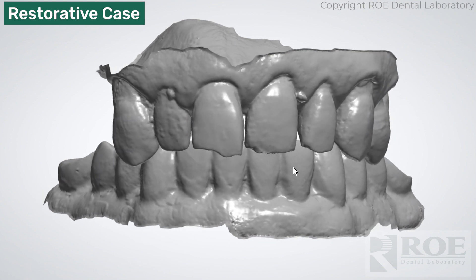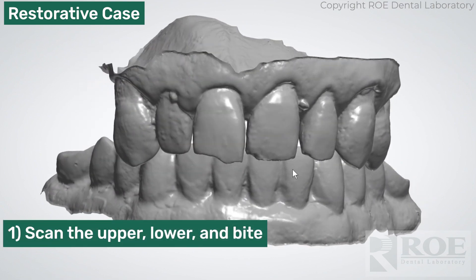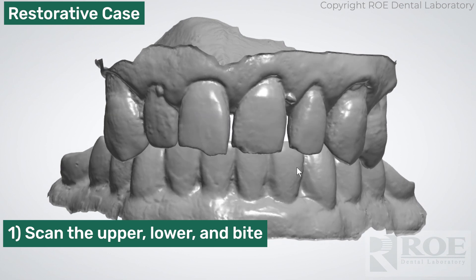Let's go through the scans. This is the first scan: scan the teeth — upper, lower, bite. Nice detail here. We just need the teeth, because this is mostly to bring in the subsequent scans.